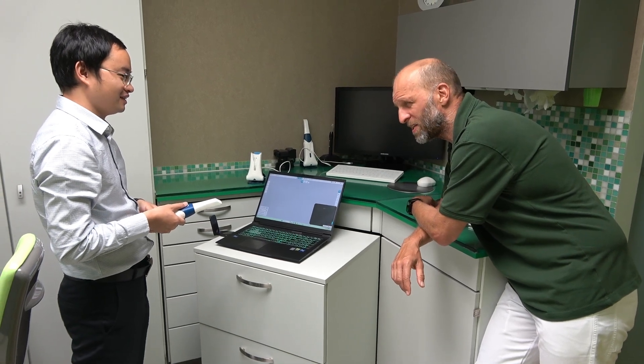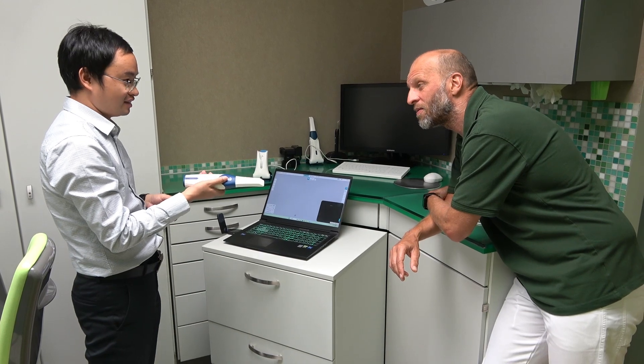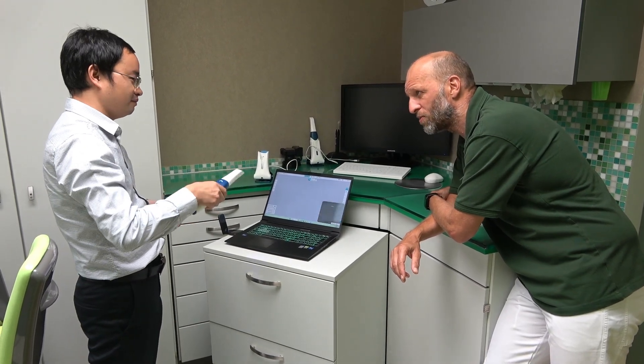You'd like to show me how quick the scanner is. The wireless scanner — how is the reverse design of the wireless scanner? Rock and roll?